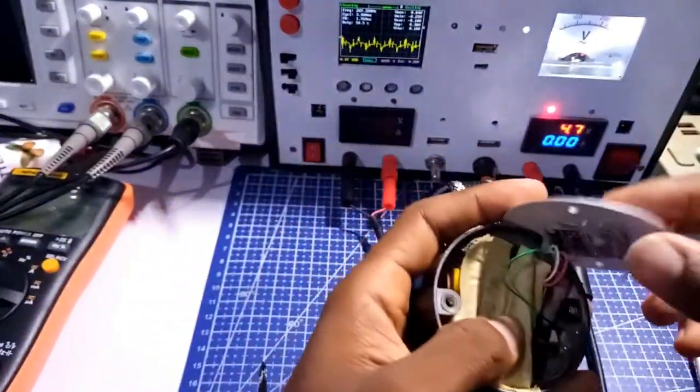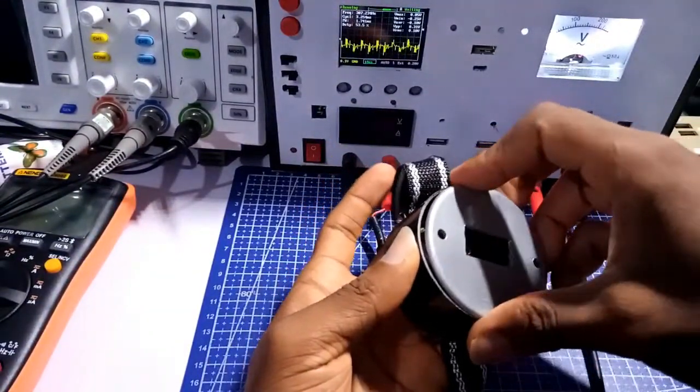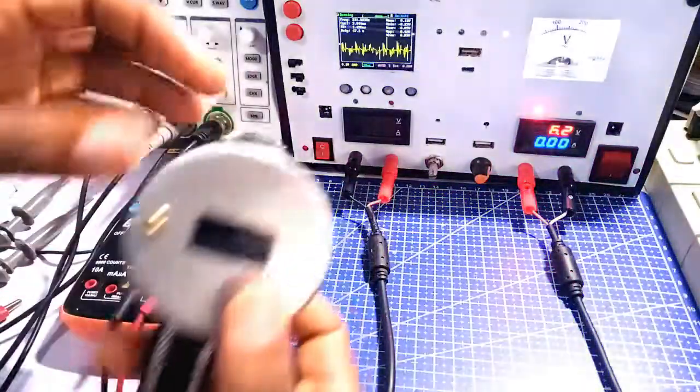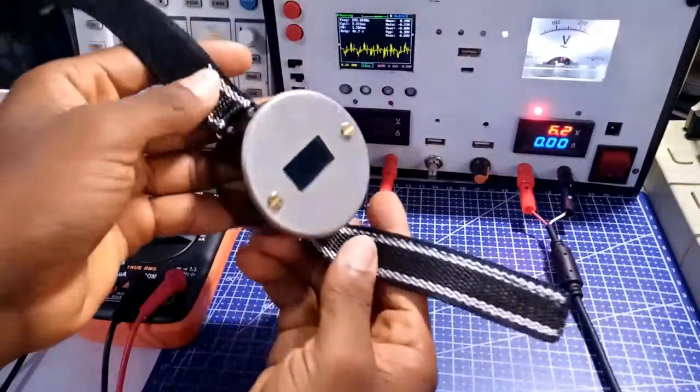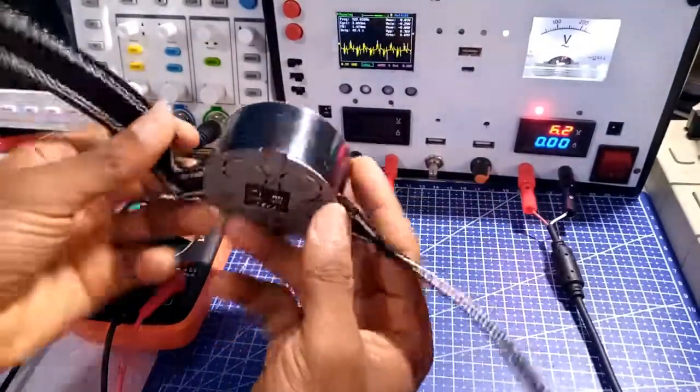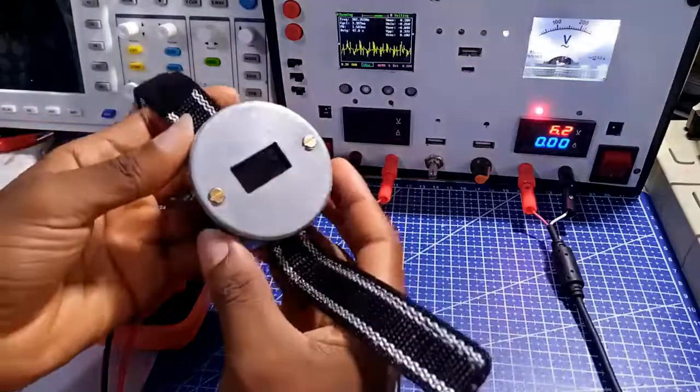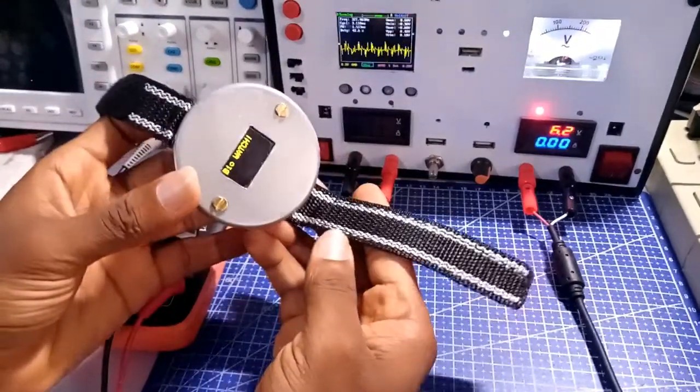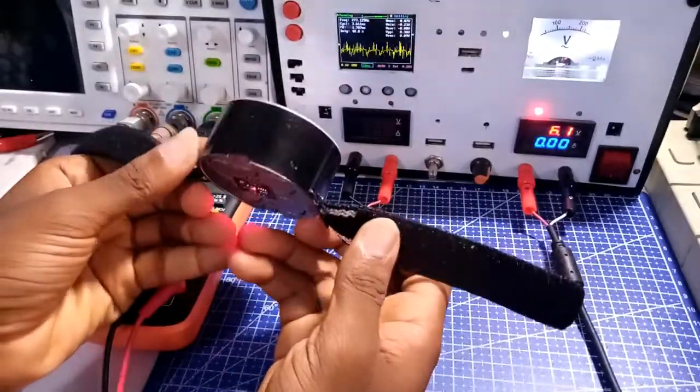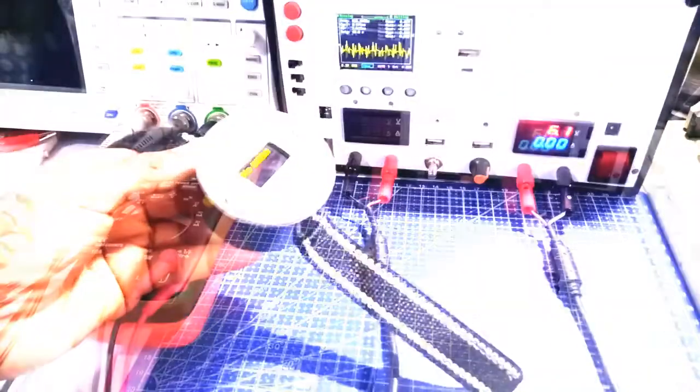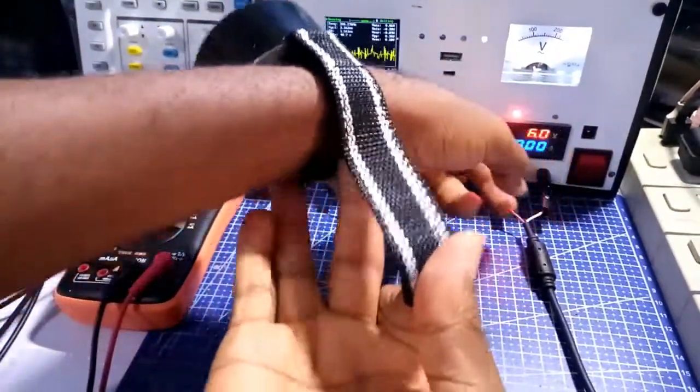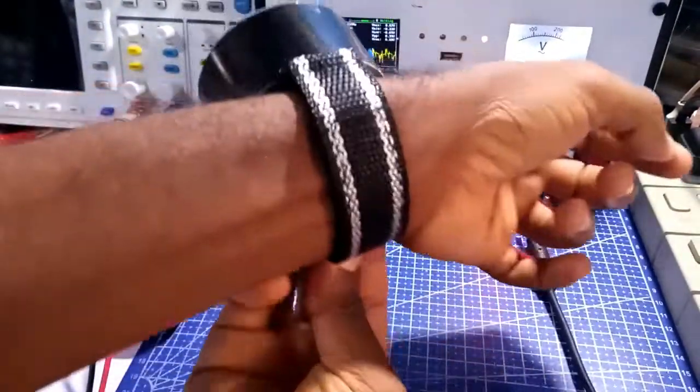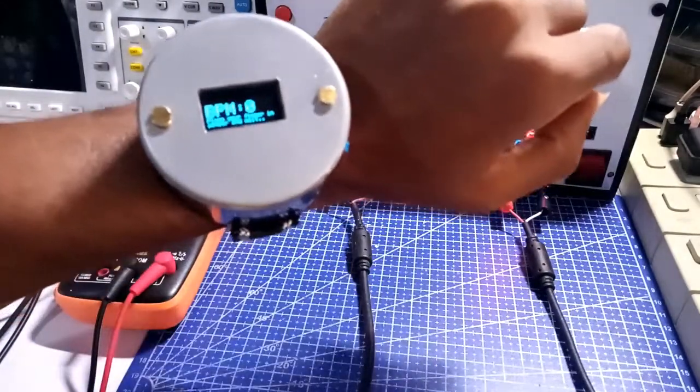Now, the assembly was well fitted as I now have my project looking like this. On testing the project, I realized that I'm not getting reading when the sensor is placed on the wrist of my hand or any flesh part of the body.